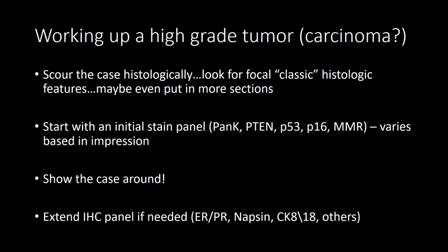There are some steps that I follow, and I think as long as you remember these steps and some of these panels that we're going to talk about, these tumors can be a lot less intimidating, and it gives you a framework for attacking them every time you see them.